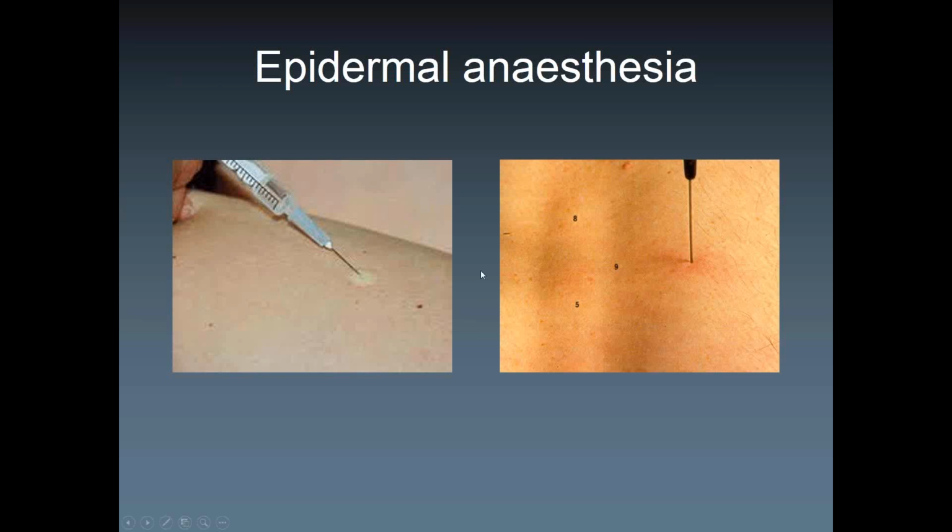What I prefer more is this one here. So remember, a mosquito doesn't sting much, but it does to some degree. One of the reasons could be that it's just a very superficial injection or sting. The other reason is that it goes in perpendicular. So if you're a mosquito, go in really perpendicular to the skin and start injecting right away. The reason is that the tip of the needle has a certain bevel, and that bevel obviously is not always facing the skin when you do this one here. If it does, even better, but be aware that you really face the opening towards the skin, so you're injecting lidocaine immediately once you're in there. But if you don't pay attention to that, this approach can also be helpful and cause less pain.